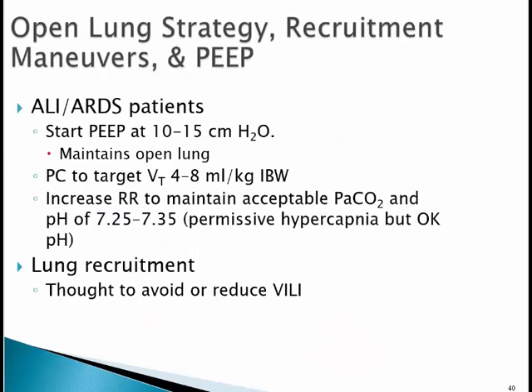Open lung strategies, recruitment maneuvers, and PEEP. In acute lung injury and ARDS patients, you want to start the PEEP at 10 to 15 centimeters of water. And this is important, we get this on before the ARDS sets in, so that when the condition occurs, we already have the PEEP on there and the lungs are already open. So we don't have to open them after the condition has set in. So this 10 to 15 centimeters of PEEP maintains an open lung.